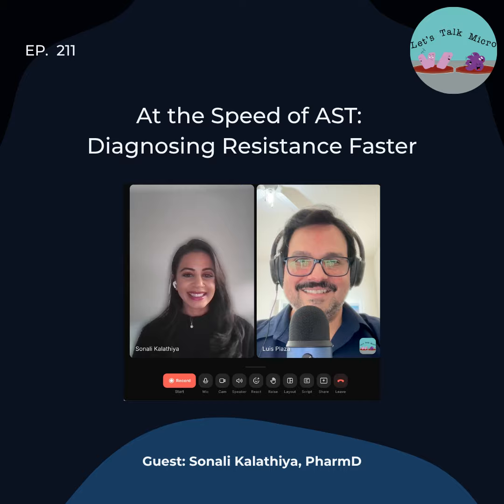Okay, so as we like to do here, we like to start with the basics and breaking things down. For those that are unfamiliar, what exactly is fast AST and how does it differ from traditional AST methods? Yeah, so traditional or conventional AST is phenotypic antimicrobial susceptibility testing that's performed on colonies, right?